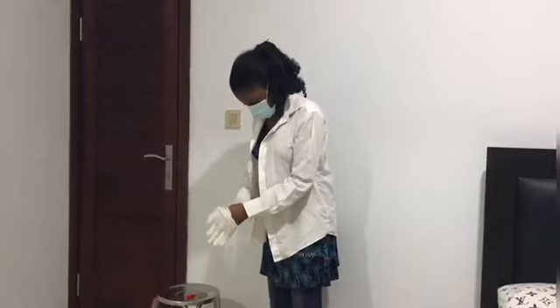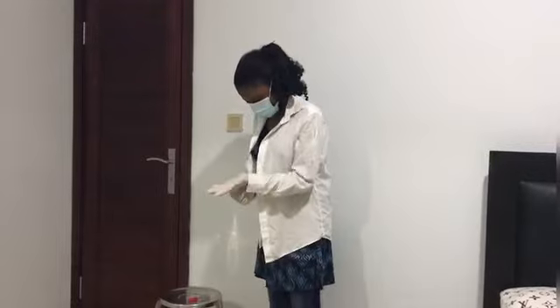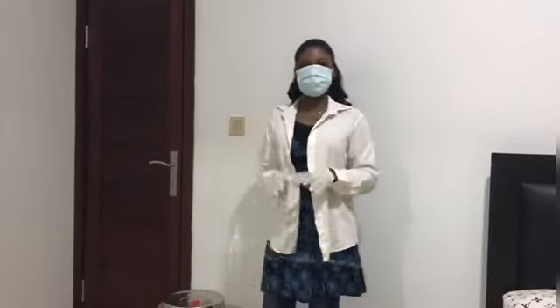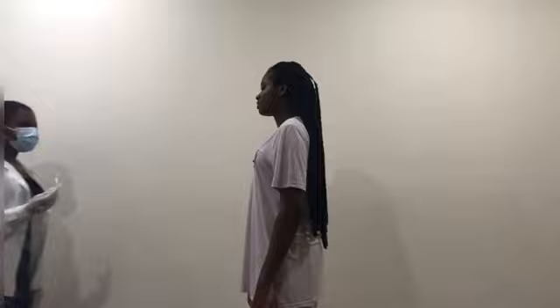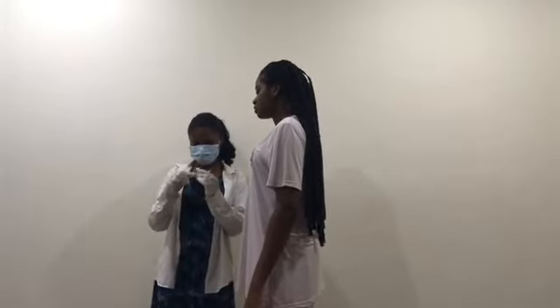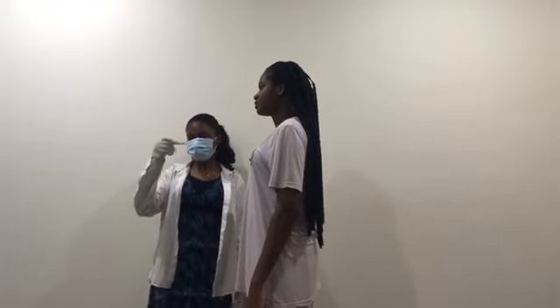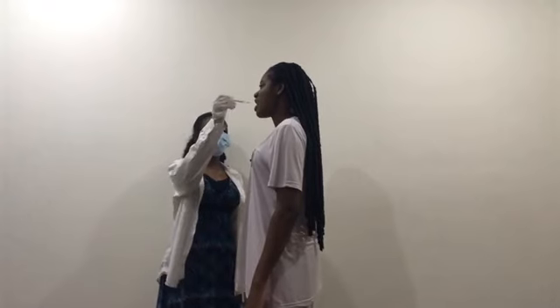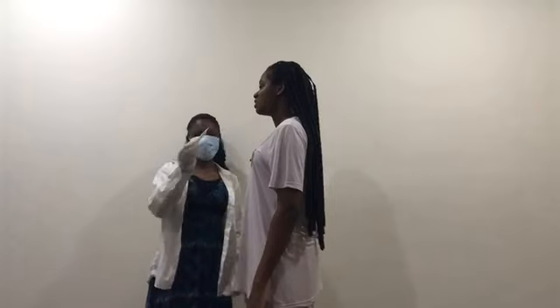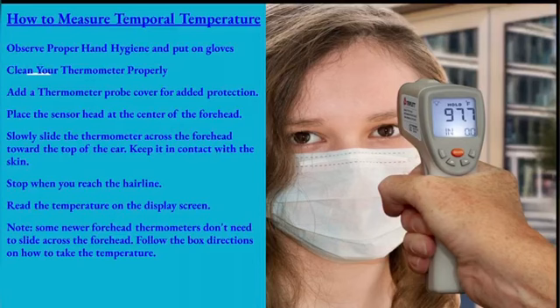In case you're using an analog thermometer, ensure that the reading starts from the base level. If it doesn't, you are to shake the thermometer lightly before taking the temperature of the patient. Ask the patient to raise her head and then put the thermometer under the tongue for a few minutes, and then after that, check the reading and document it properly.